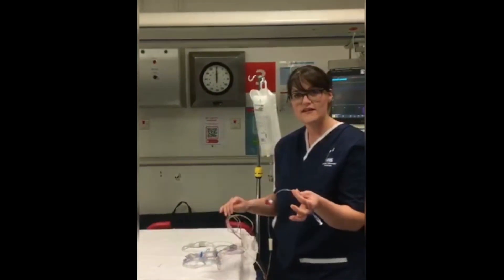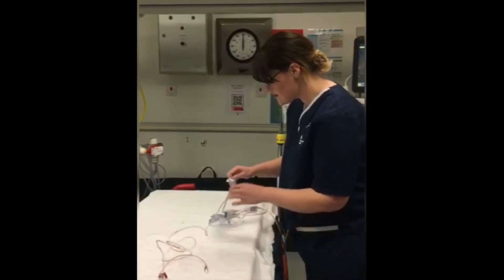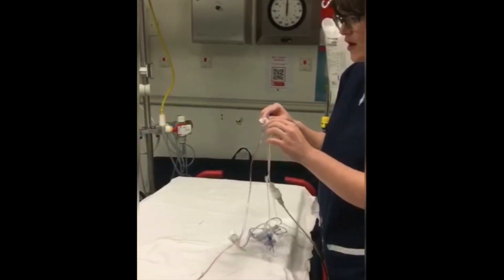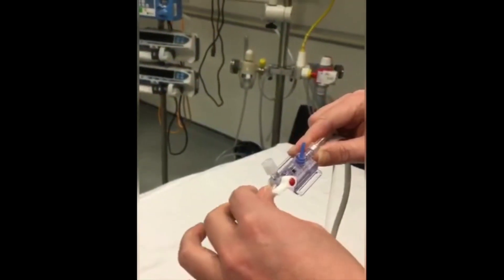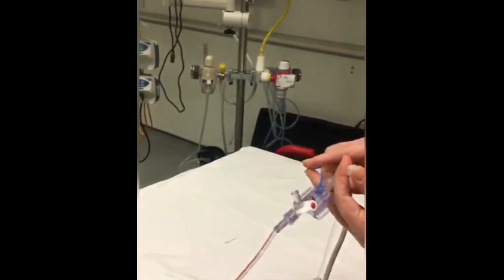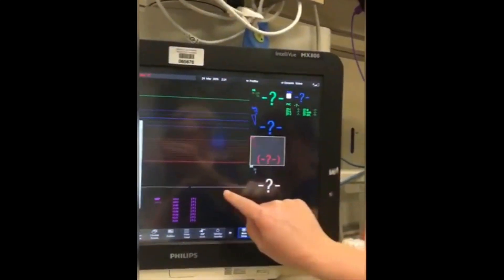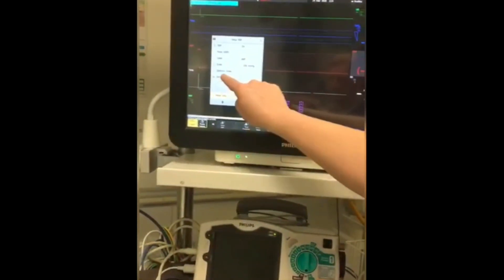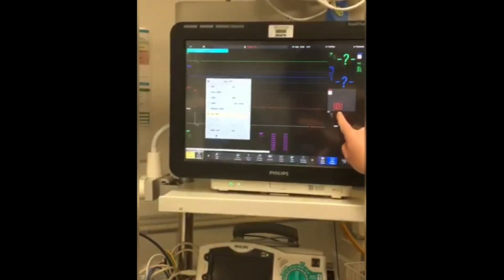Once the doctor has placed the line in, this line needs to be zeroed. Make sure it is all connected to the patient, then turn the lever off to the patient so it is open to air. On the monitor, press the question mark, go down to zero, and wait for the beep.